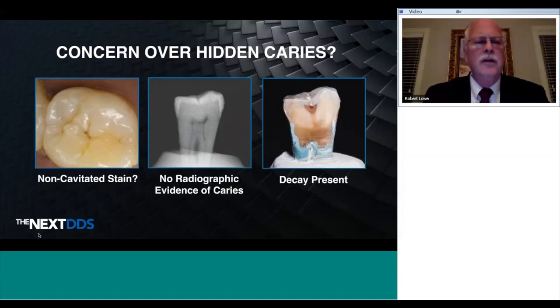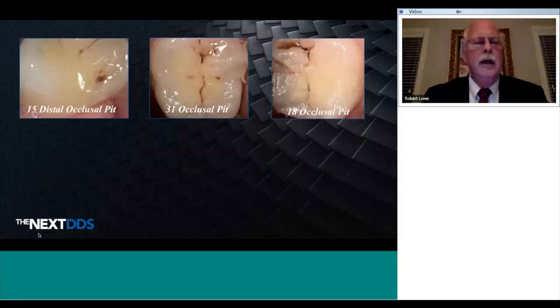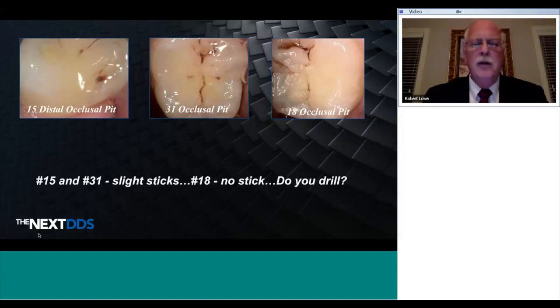So early diagnosis, I feel, is critical. And diagnosing with only an explorer, is that really the best way? Here we have three different clinical situations, different patients. Number 15, occlusal pit, 31, occlusal pit, 18, occlusal pit. Number 15 and 31 are slight sticks. I don't know what a slight stick means. What's a slight stick? Is it a slight cavity? Is the tooth slightly pregnant? I don't know. It's either got decay or it doesn't. So what's your choice? Do you drill? Do you restore? Do you watch? Do you let it get bigger? In a day where most people are living well into their 80s, don't you want most people to have their teeth when they're 80? I certainly do.